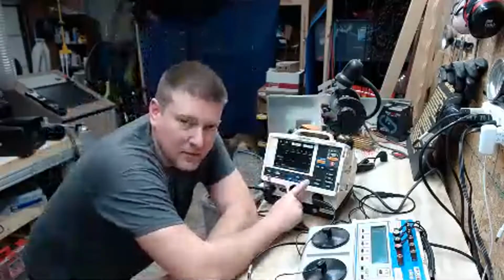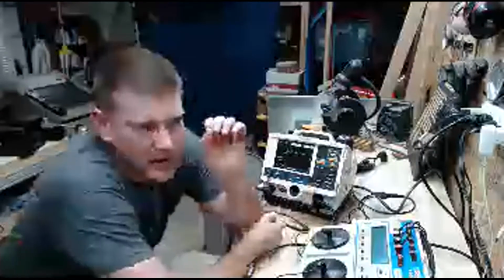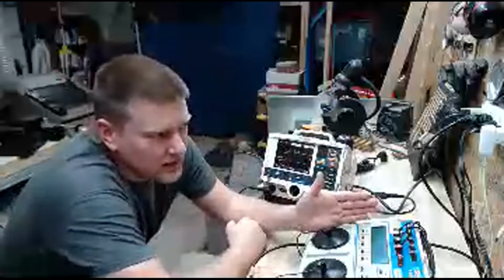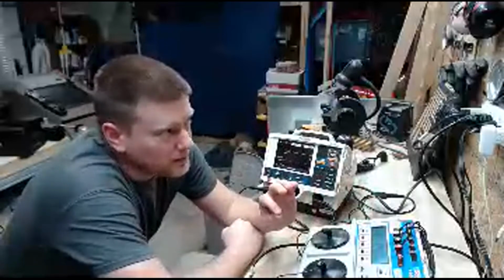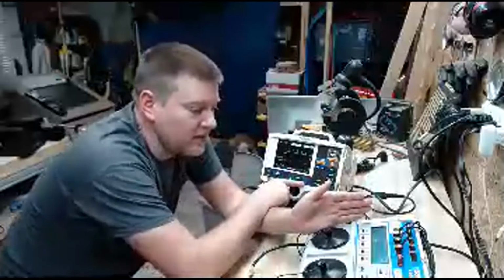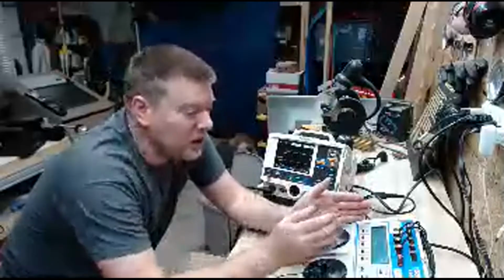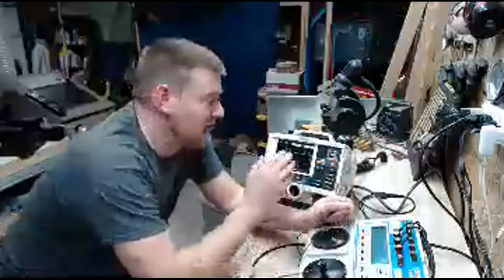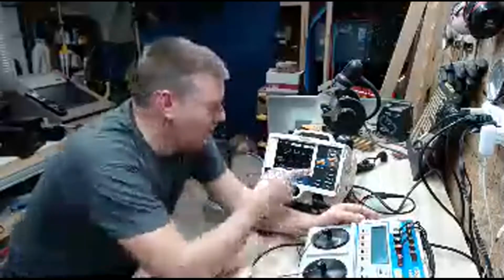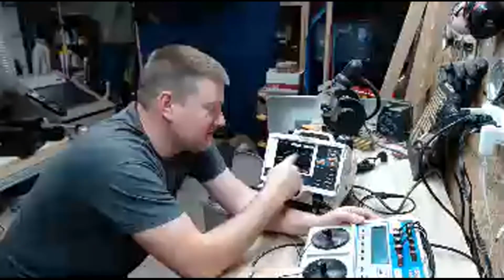Some of the defibs have an async/sync option for pacing. Synchronous means that if the heart is trying to beat at a certain BPM and it falls below that, then your defib will take over. Asynchronous mode is when the defib doesn't care what the patient's heart is trying to do. It's just going to beat for him. You tell it to beat at 100 beats per minute, and it's going to give the 100 pulses regardless of what the patient's heart is doing.